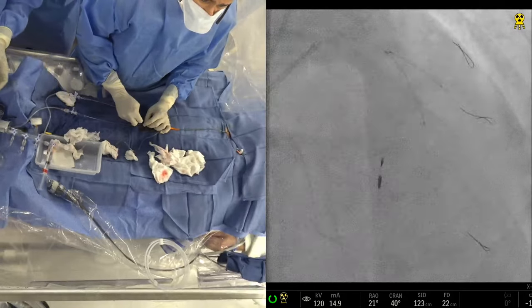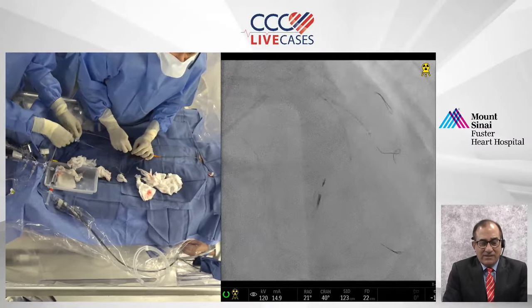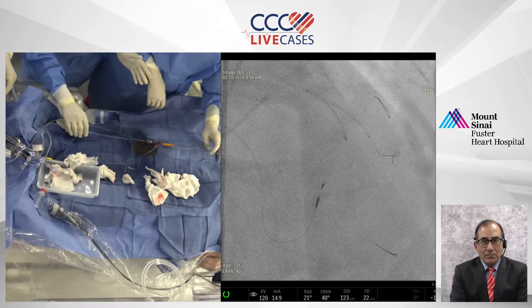I have a dozen people on chat having two dozen different techniques. Yep, this is good. It is fascinating. How will you place the D1 stent? Yeah, one second. Give a little die.